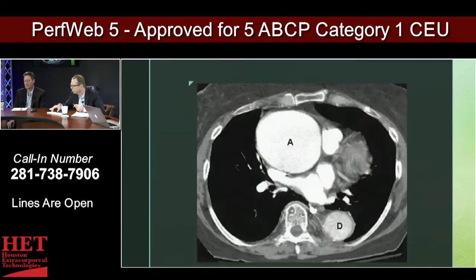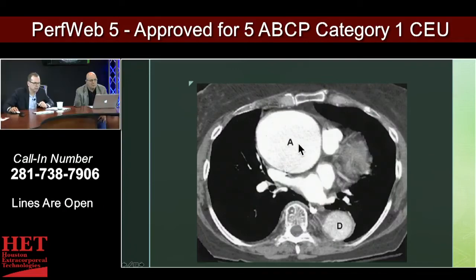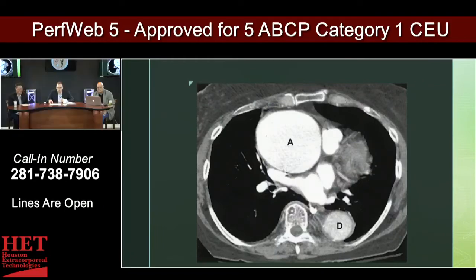The esophagus is cheap, no radiation, and really benign. This is a huge ascending aortic aneurysm — the A structure is ascending, the D is the descending — and you can see how it occupies most of the anterior mediastinum, displacing everything out of its way. How do you ever put a clamp on that? Maybe you don't — you may just go circulatory arrest and then deliver antegrade cardioplegia to the root after you open it.